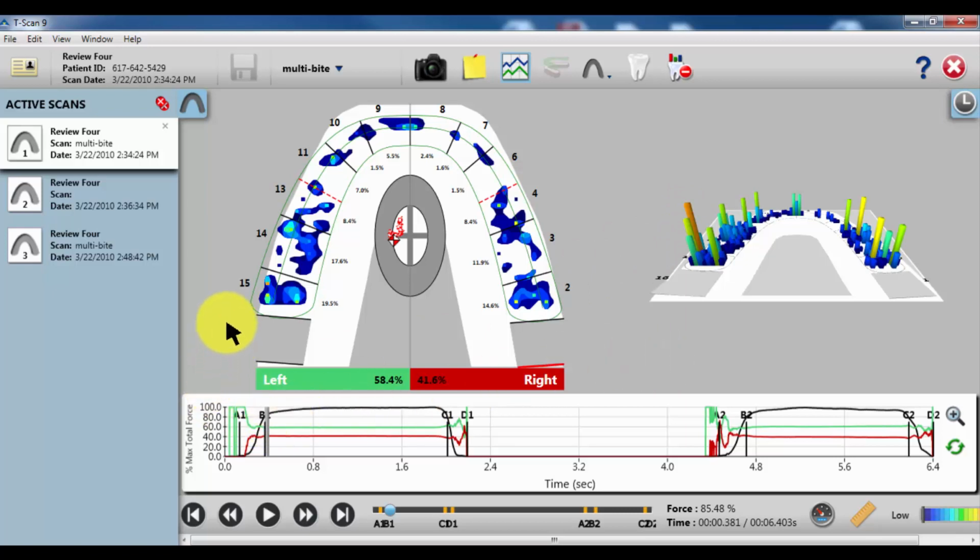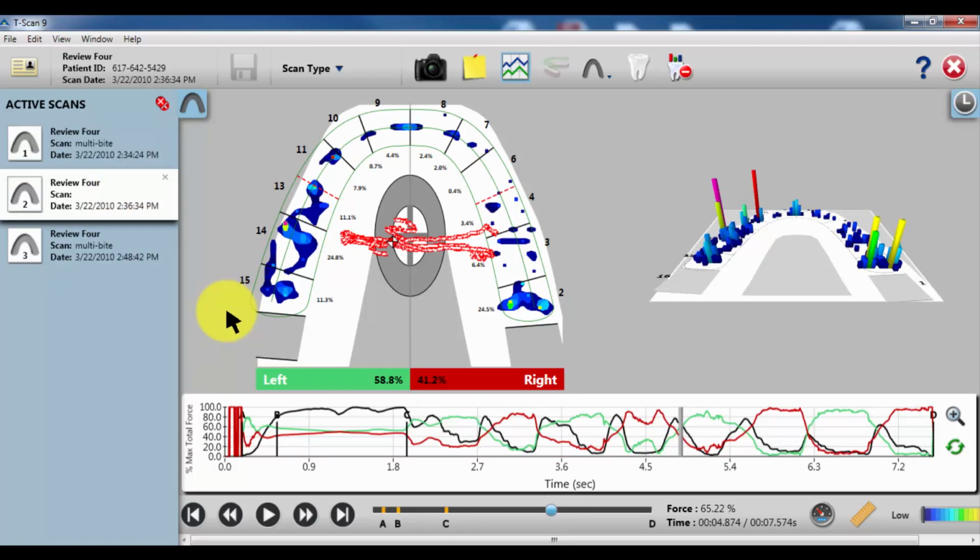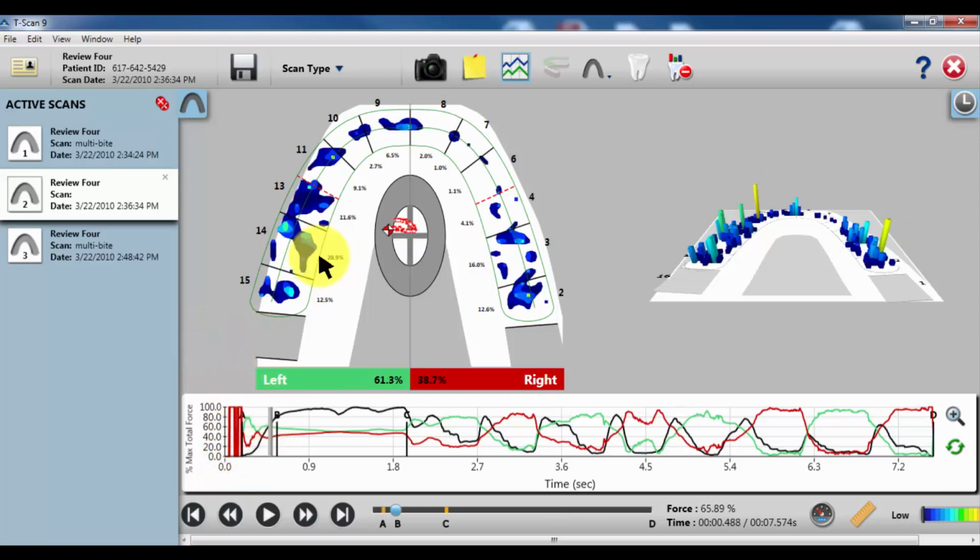And so the doctor here took it to the next level and asked the patient to bite down on the sensor and reenact the movement that causes the pain. And so this is called a crunch and grind recording. There's a second recording here, and you can see the A to B area is very similar, low forces.